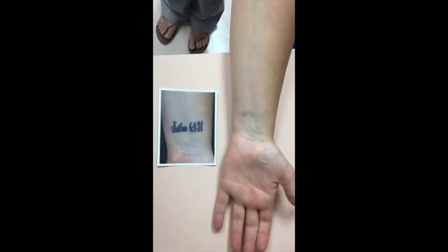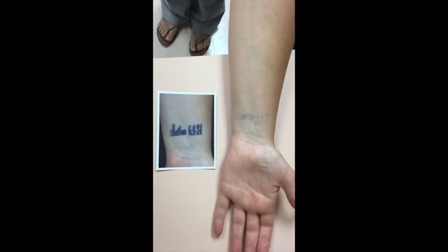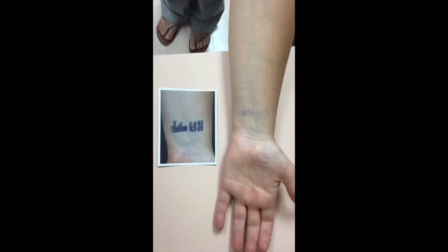So we're just doing an image of the tattoo before and after several treatments.